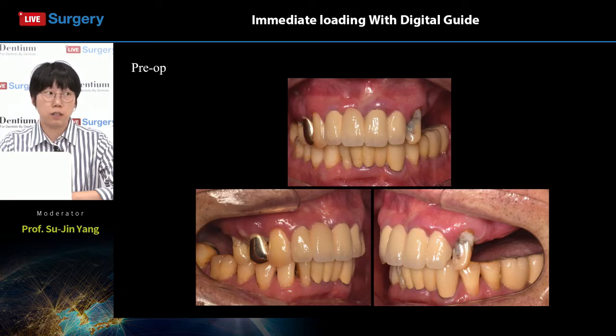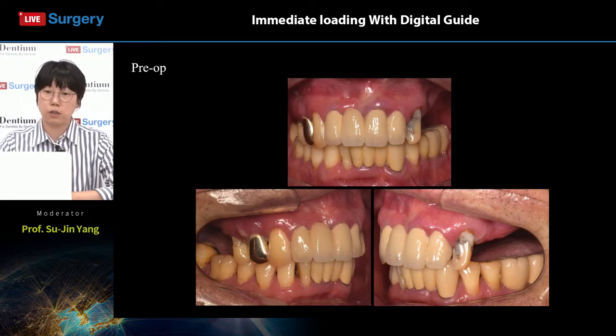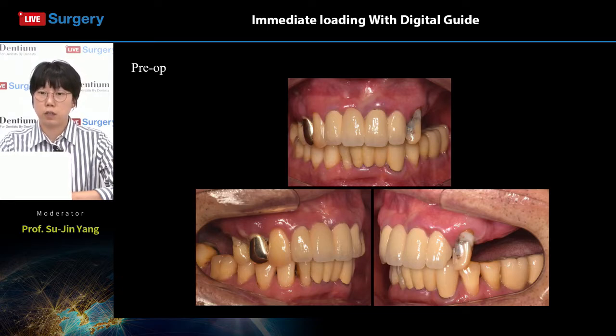Now, these are the intraoral photos of the patient. Mild overjet and overbite of 2 to 3 millimeters can be seen from the frontal and lateral views. Tooth number 15 and 45 are acting as the vertical stop of the patient. Tooth number 14 shows bone loss along the full length of the root.